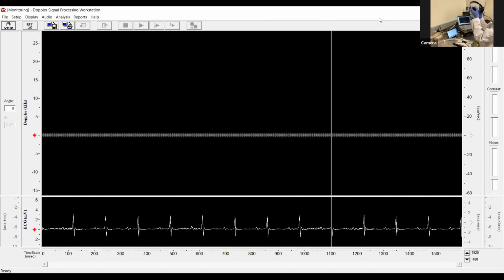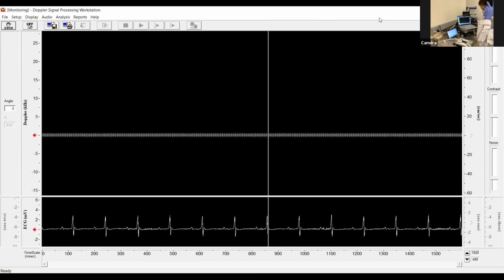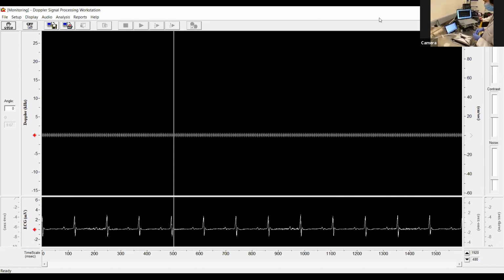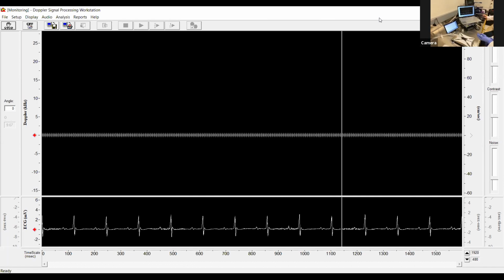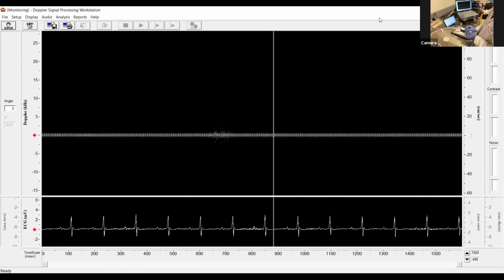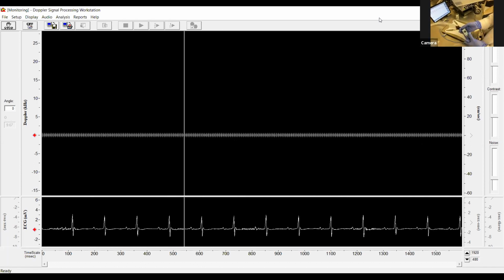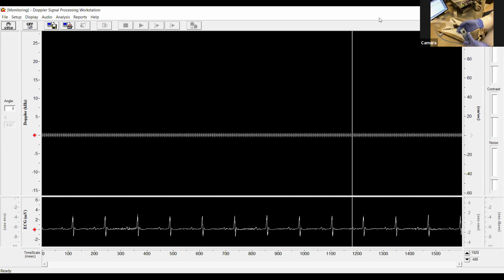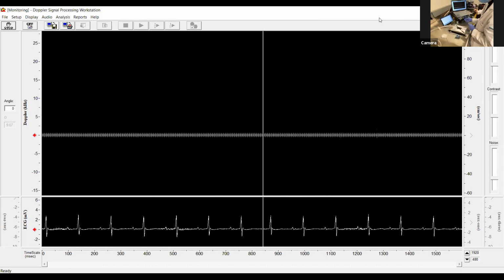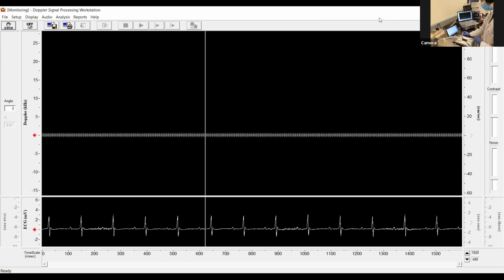And I think to start, we were going to do the mitral valve. I can obviously hear Sydney, so as much as she's saying anything, I can convey that to you as well. Okay, so to start, Sydney's just going to set the depth on this remote. That basically shows how far from the tip of the probe we're listening for the sound signal to be coming from. For each measurement, there's a specific setting that we use as a guide, but that all depends on the species you're working with, of course, and the size of that animal.